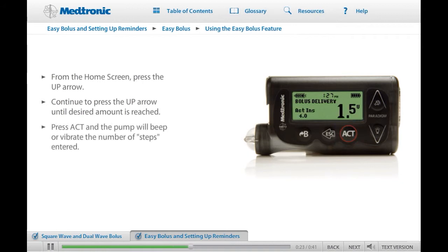The pump will now count back in beeps or vibrate the number of steps you have entered. If the number of steps is correct, press Act to start the delivery. When you first use the Easy Bolus feature, watch the screen as you press the Up arrow button. You'll learn that a different beep will occur for each step.